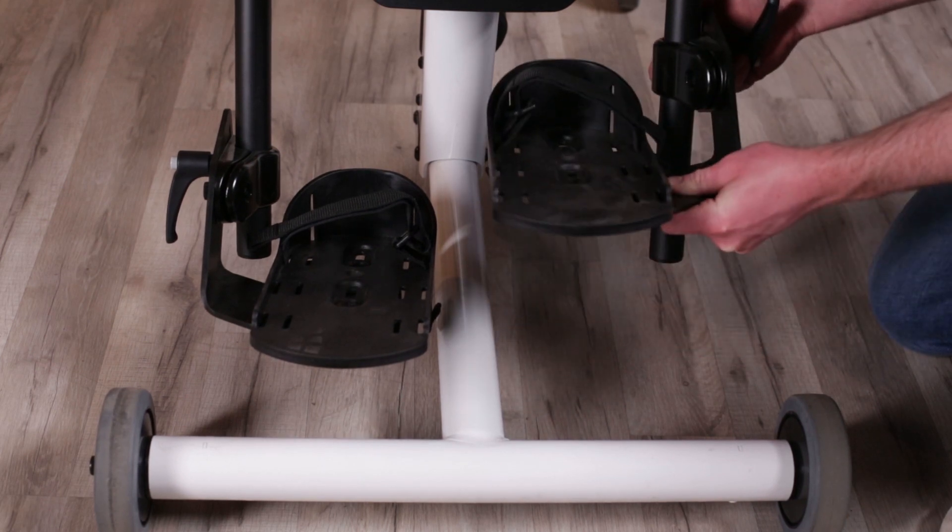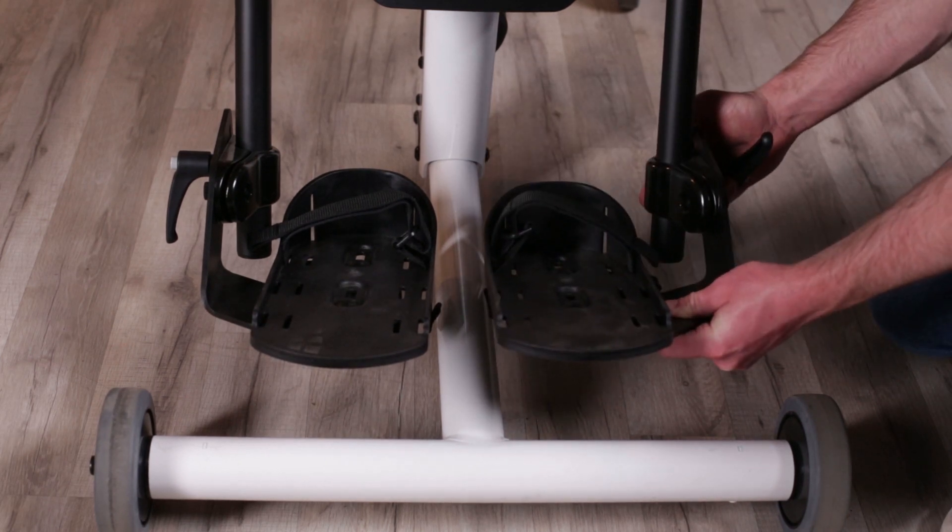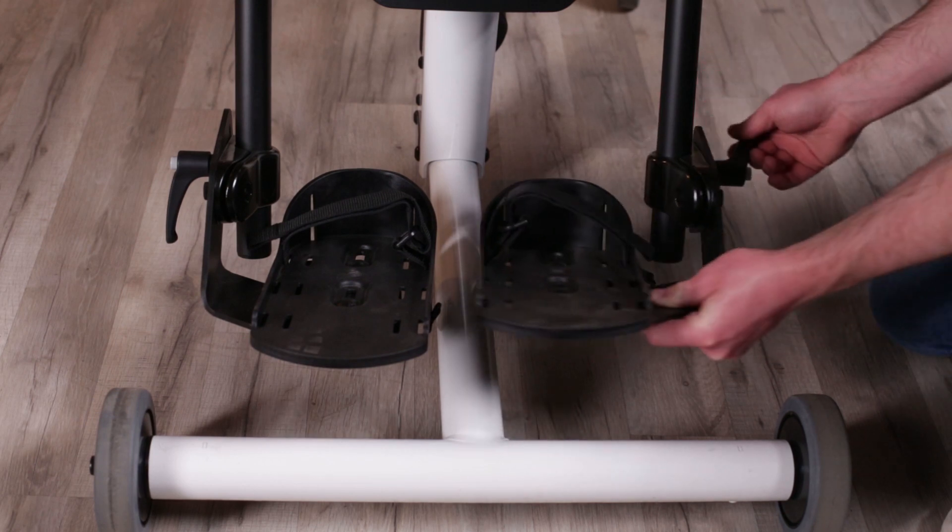Multi-adjustable foot plates are adjustable forward, aft, plantar, dorsal, toe in, toe out, swivel, and in height.